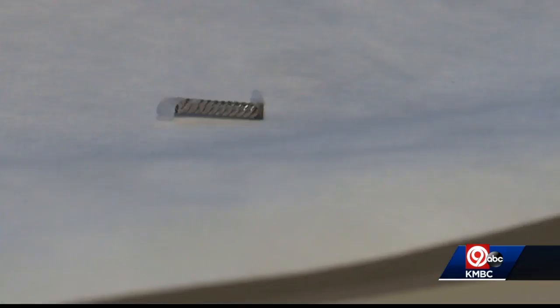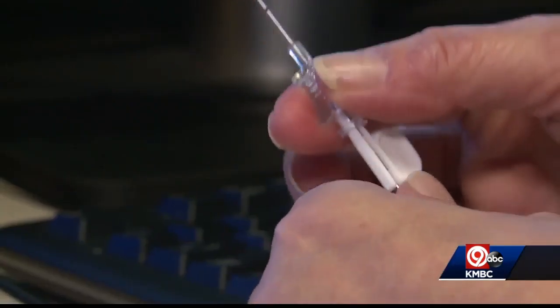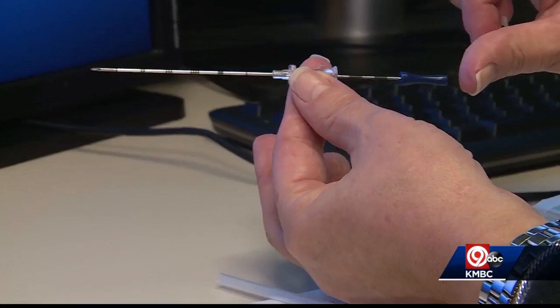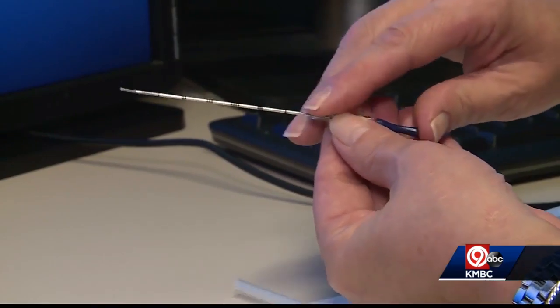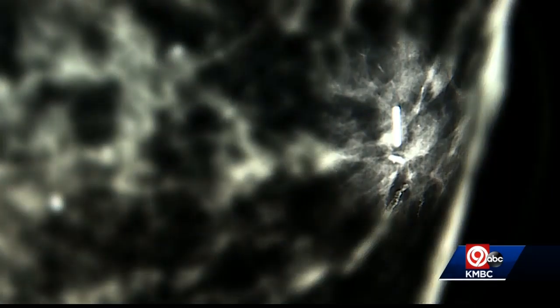MagSeed is a 5-millimeter magnetic marker smaller than a grain of rice. A radiologist showed us how it's inserted: "So what we're going to do is kind of plunge it through, and it's going to pop out the end." This is what it looks like inside the breast, pinpointing the cancerous tissue.